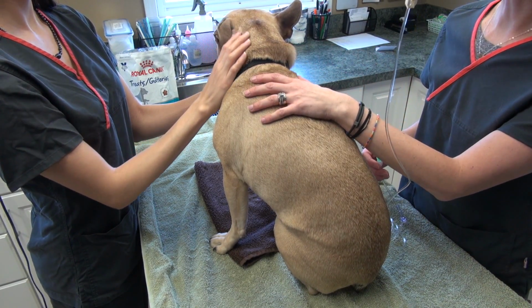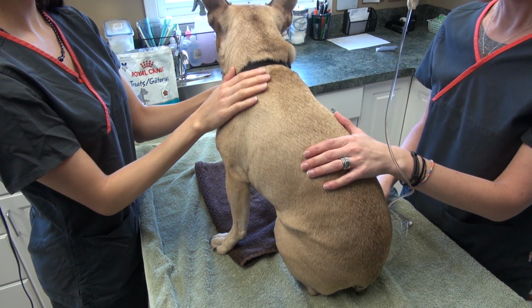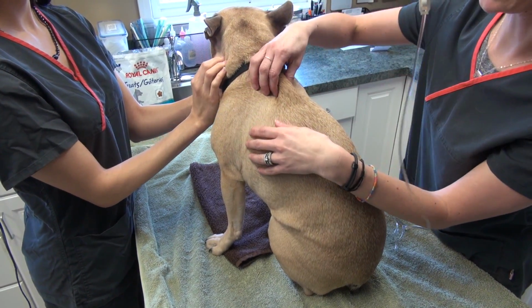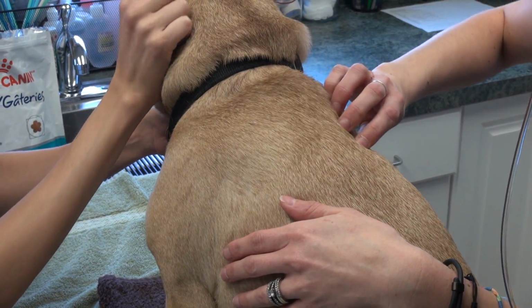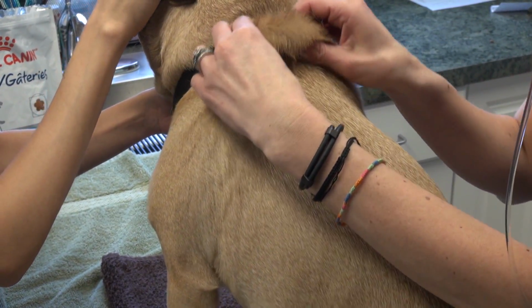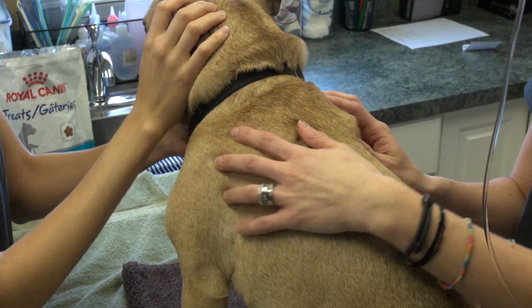Okay, so we have our patient up on the table and we're gonna show you how to administer the subcutaneous fluids. So mostly we go along the shoulder line. There's a lot of extra skin here. We call this tenting the skin when we're doing it. You can go anywhere along here. Realistically, you can go back here, but animals just have a lot of loose skin here, as you can see he does. So this is where we like to go. You can fill it up with fluids.